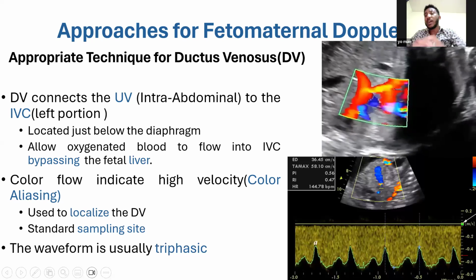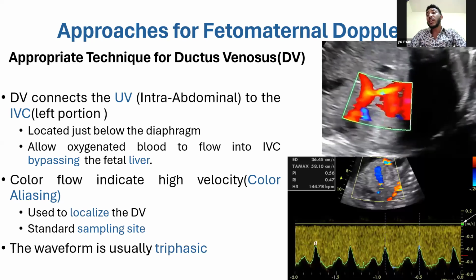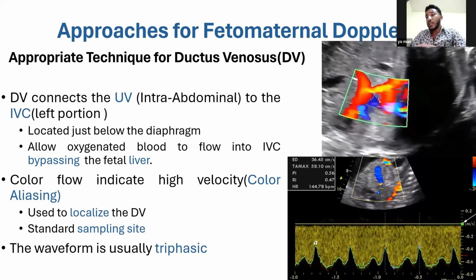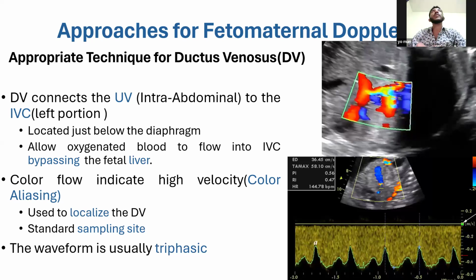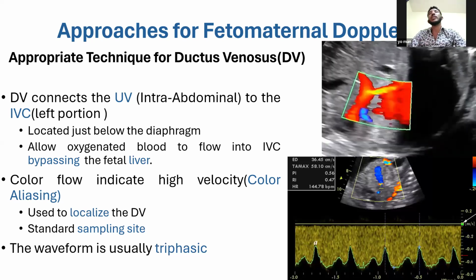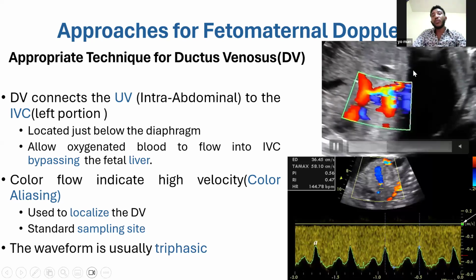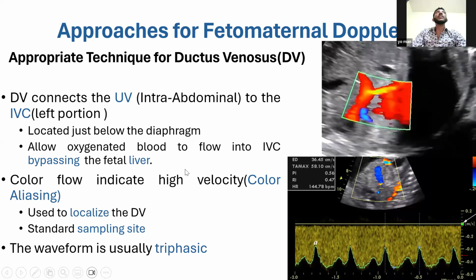Anatomically, the ductus venosus has a pipe or small caliber at the end. It helps to eject blood directly into the right atrium, then through the foramen ovale to the left atrium and left ventricle. That pressure is created by the pipe or the small caliber at the end of the ductus venosus or at the end of the isthmus.